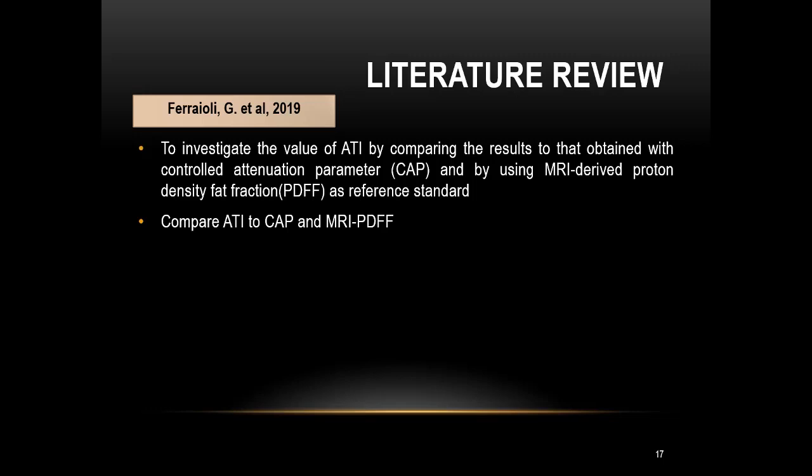There are other modalities that can quantify the fat content inside the liver. The previous one is the controlled attenuation parameter, or CAP. This is a modality inside the FibroScan machine that also uses the same technique of sound attenuation to quantify fat content.